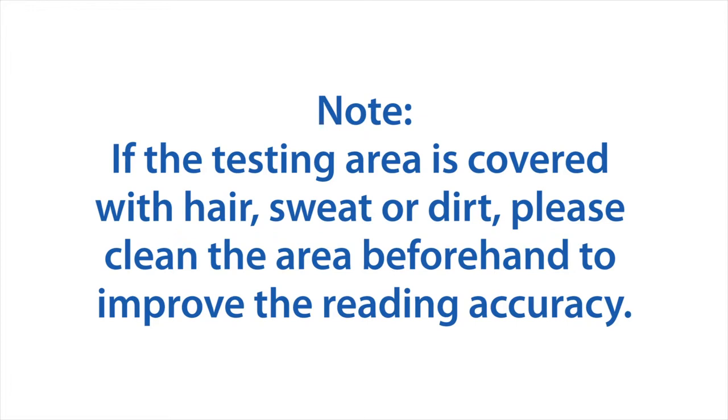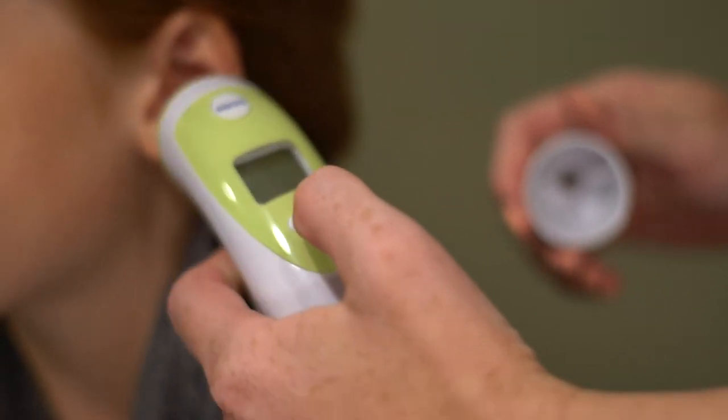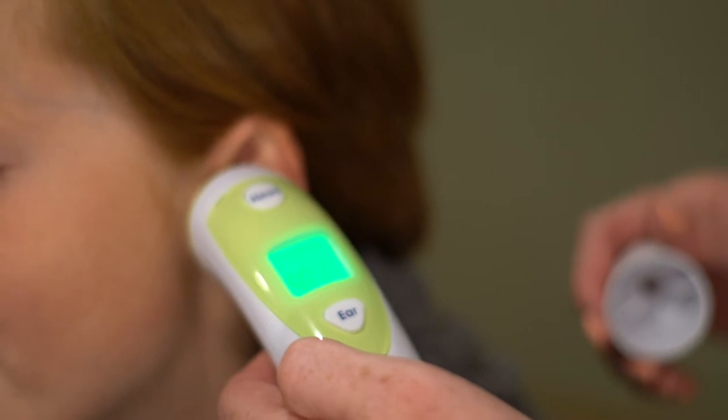If the testing area is covered with hair, sweat, or dirt, please clean the area beforehand to improve reading accuracy. When taking your ear temperature, take off the probe cover and insert the sensor into the ear canal, then press the ear button.